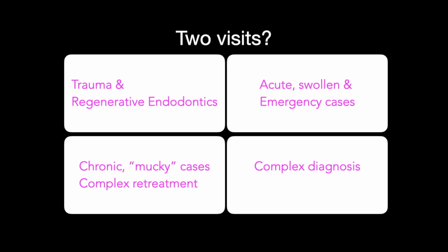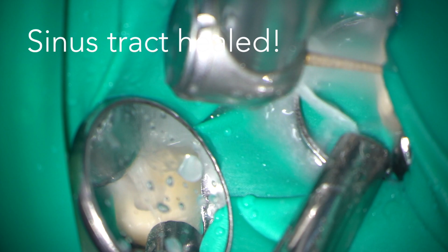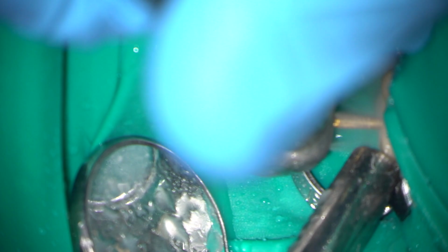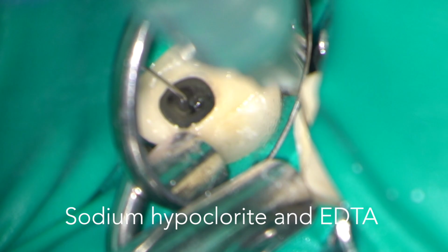We're now joining the case at the second visit, and we're going to remove the temporary restoration and the calcium hydroxide from the root canals. I use a combination of sodium hypochlorite and EDTA with some agitation to remove the calcium hydroxide. The eagle-eyed amongst you will have already noticed that there are actually two distobuccal canals.